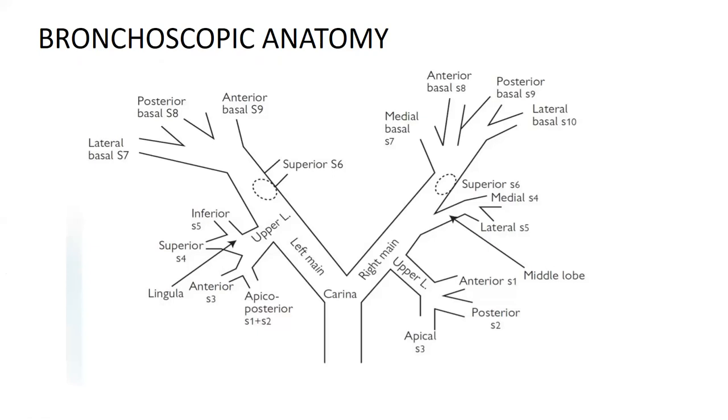So this is the schematic diagram. This is the schematic representation of the bronchoscopic anatomy, as explained in the previous slide, shown in this slide.